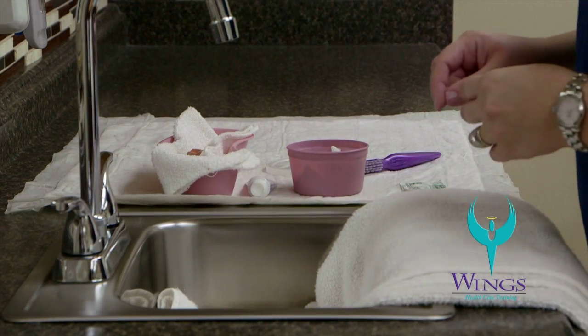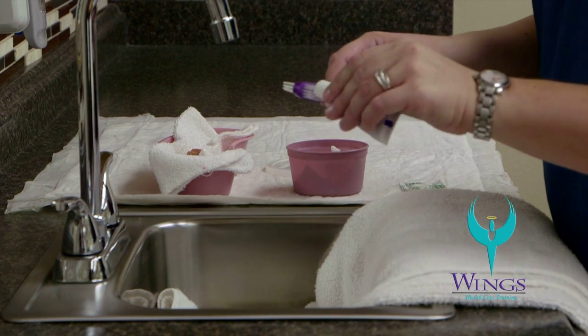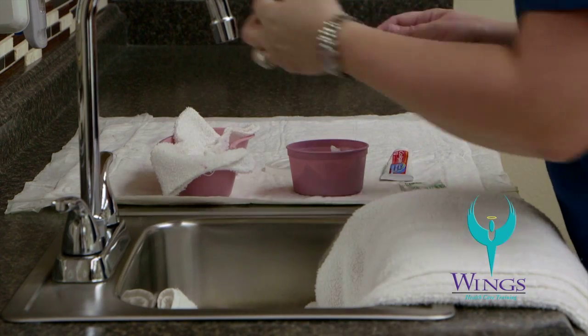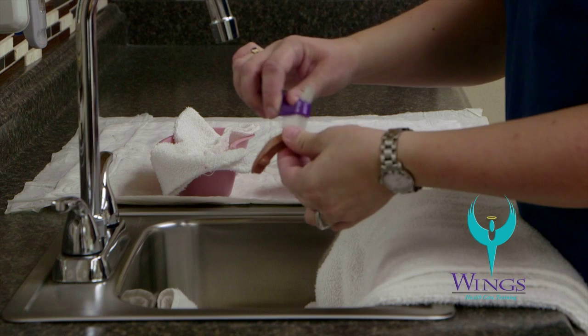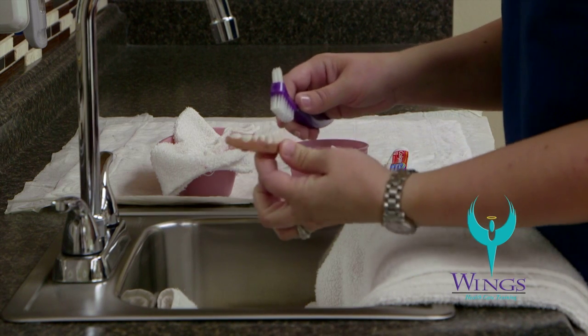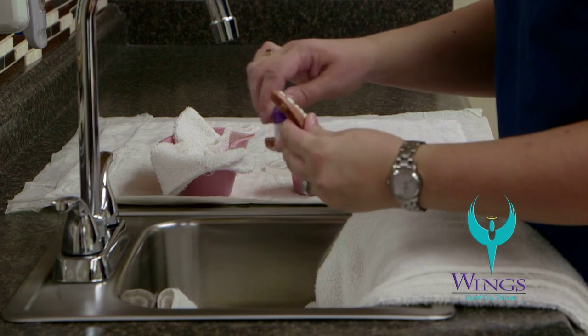Adjust the water temperature so that you have cool water running. You will take the toothpaste and apply a small amount to the denture brush. Take the lower denture plate and start by cleaning all of the surfaces of the denture. Make sure to hold the denture in the middle of the base — do not squeeze from the outside edges, as that will cause the denture to break.